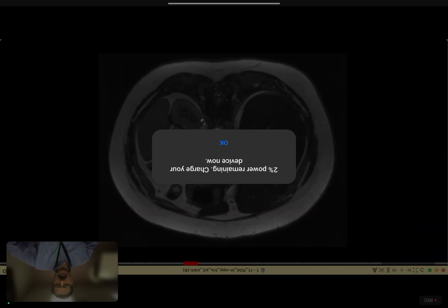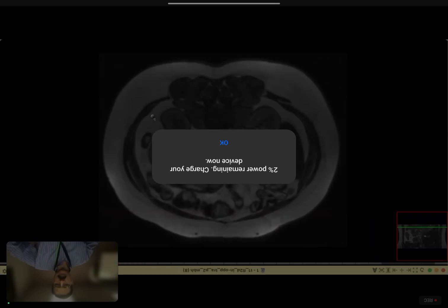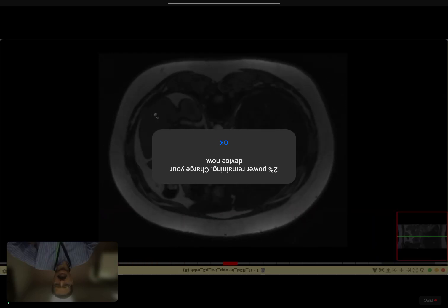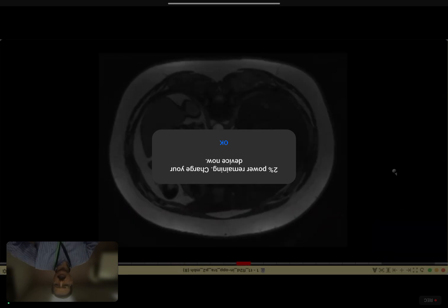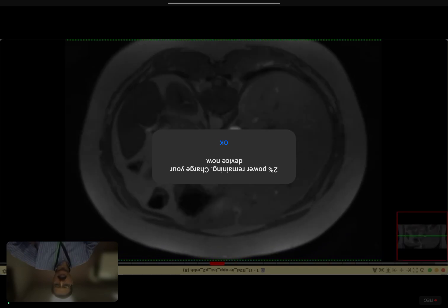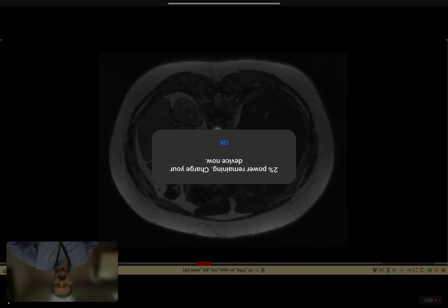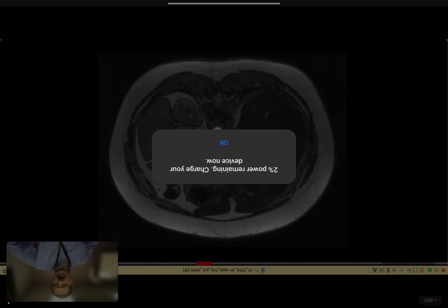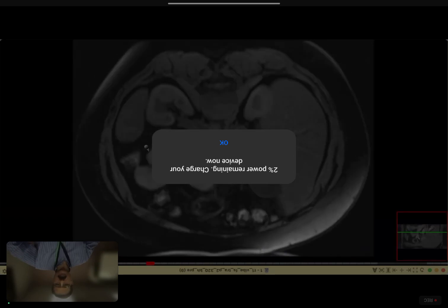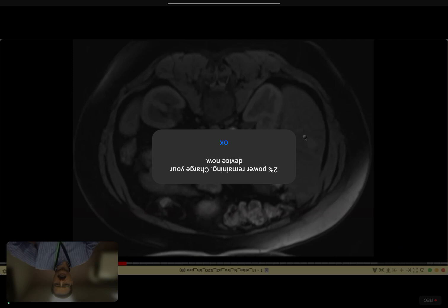If you look at the outline of the various organs, they have got a black line, and this is known as India ink artifact or etching artifact. Look at, around the spleen, around the kidneys, etc. And we can see, actually, you should have access to both side by side, but you can make out that this is the signal intensity of liver. And on the opposed phase, it becomes black, means it is lot of fat inside. So there is fatty change. Now, this is pre-contrast T1 weighted sequence. It is fat saturated. And this is the lesion somewhere here.